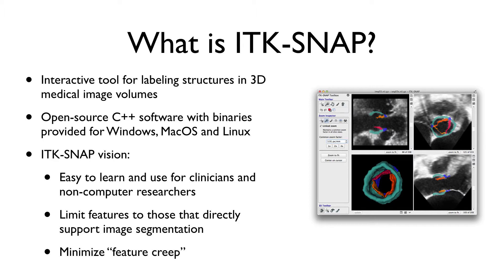We want it to be easy to learn and use for clinicians and for researchers who are not necessarily computer scientists or computer science graduate students. Over the years we've tried to limit the set of features in the tool to those features that really support the core mission of image segmentation, so we don't have a bunch of plug-ins for different specific applications. It's really meant to be a general purpose image segmentation tool.